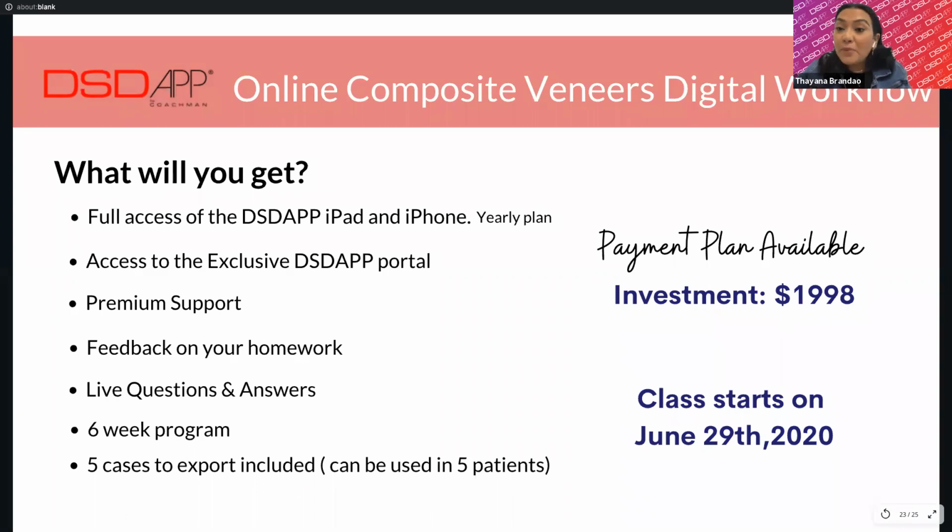If you can have a patient, we can help you to create your first case, and it comes with 5 cases to export included. It means that you can create 5 projects. You can get the return over the investment during the course. If you have patients, we can help you to do that.